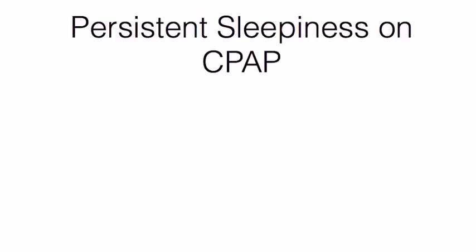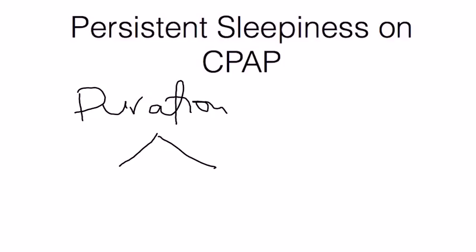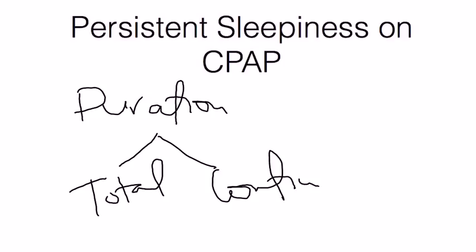The next thing to look at is the duration. Now, the duration, as I mentioned before, above 4 hours and more than 70% of the time, which is roughly equivalent to more than 2/3 of the month. But this actually has to do with more than just the total amount of time that they're on it, but also the continuity on it as well.